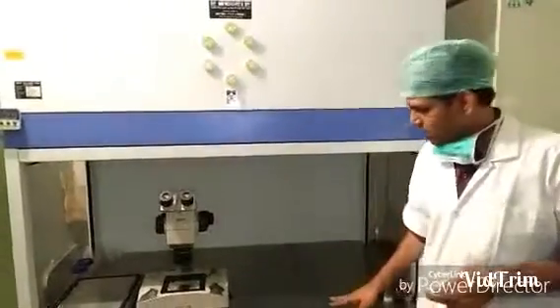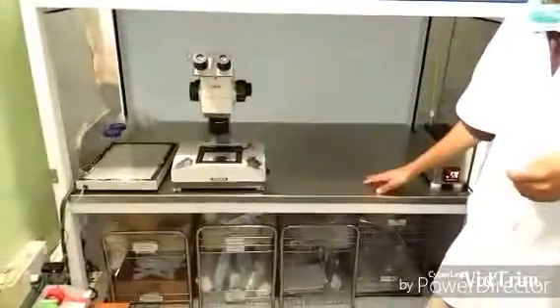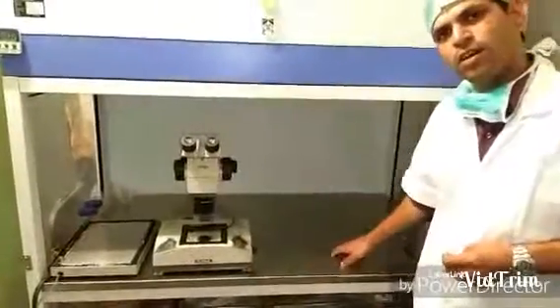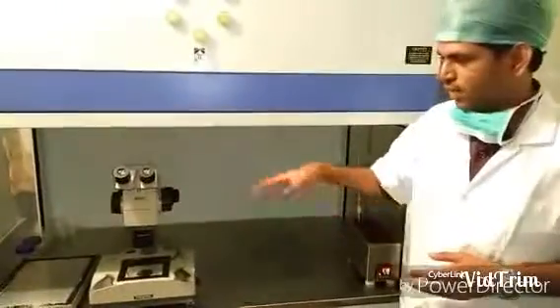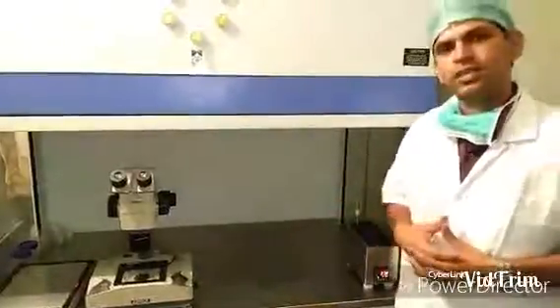The Laminar Flow cabinet is made of metal, and the surface, as you can see, is made of stainless steel, so we can easily clean it with a disinfectant. The cabinet also has an ultraviolet light to sterilize the surface and any objects kept inside.